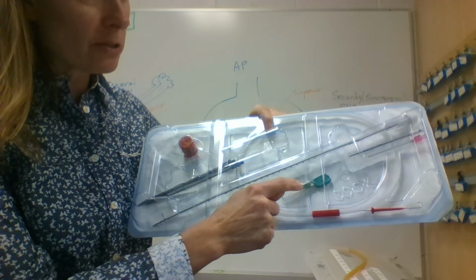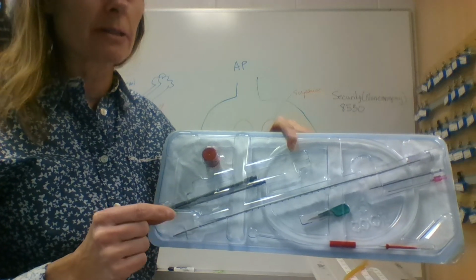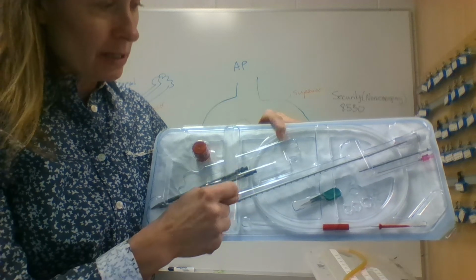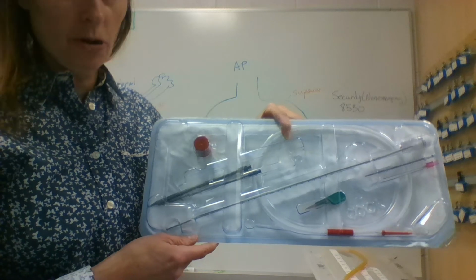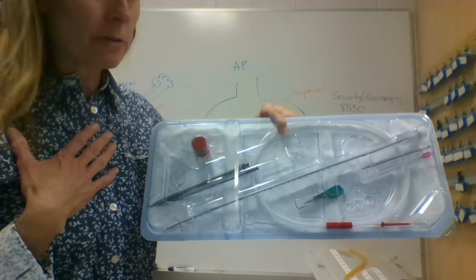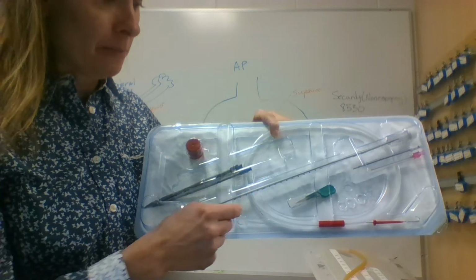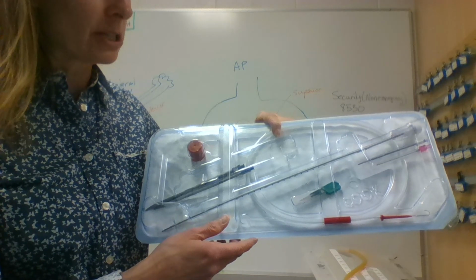And then from there, they will start inserting, as need be, the different size dilators. And the dilator itself, its purpose is to expand that nick or that orifice that we have now created. So they'll use the different dilators. Now, from a patient's perspective, this is not comfortable per se to have done, particularly because the visceral membranes in there can actually not be frozen, so we can't freeze everything, unfortunately. But once the chest tube is inserted, the patients feel way better. I mean, now they have that pressure that has been reestablished.